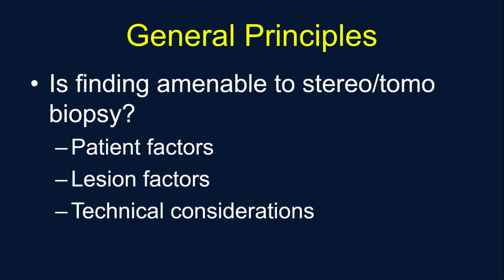Can we actually see the target? Maybe the target is so faint. Some of the systems do come with 2 spatial resolutions. The prone tables usually have what's called 512 or 1024. The advantage to using the 1024 is you'll be able to see the fainter target a bit better, but the radiation dose is also much higher.